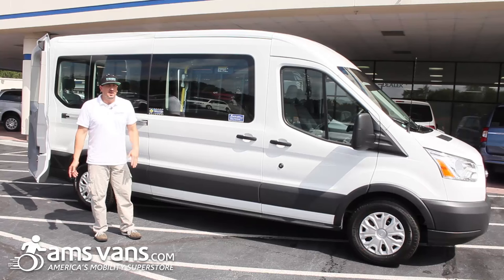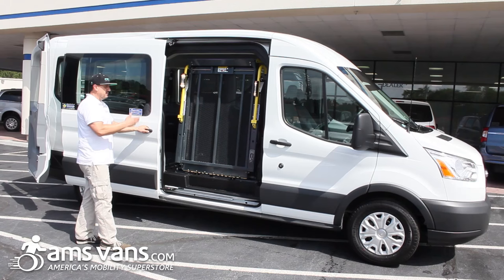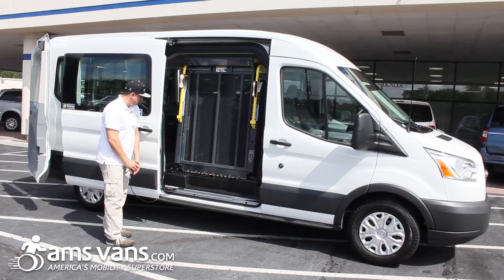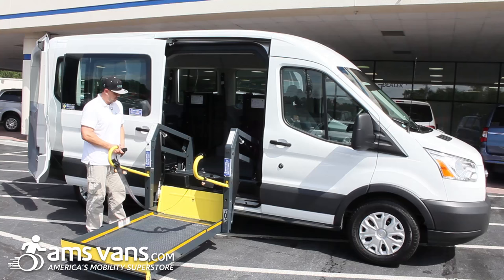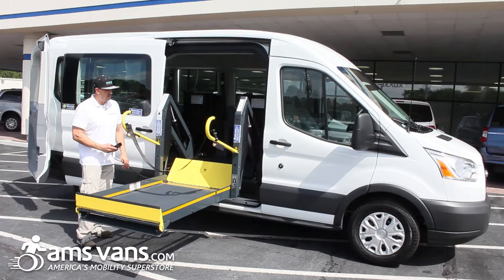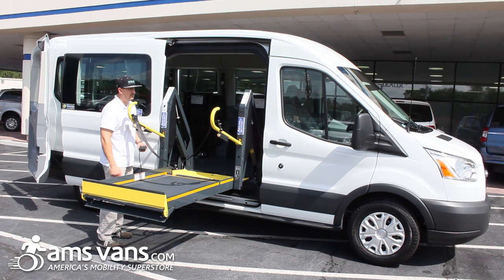Now we're going to go over the commercial side entry lift. Open your sliding door — it has an interlock so the vehicle will not go into gear when the door is open or if the lift is out. Grab your hand pendant and push deploy. The lift will come out and stop at the threshold. The client goes onto the lift and it comes down. This side entry commercial lift will hold up to 800 pounds. Once it's up to the top, we stop, safely position the client where they're comfortable, lock them in place, and we're ready to go.